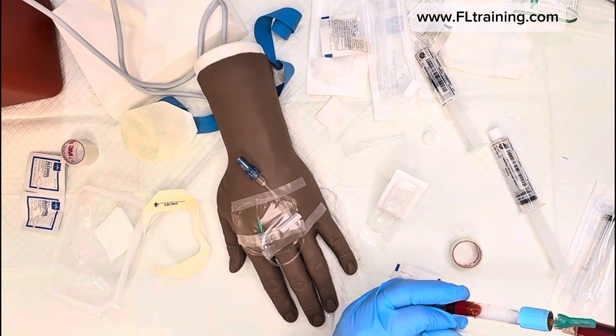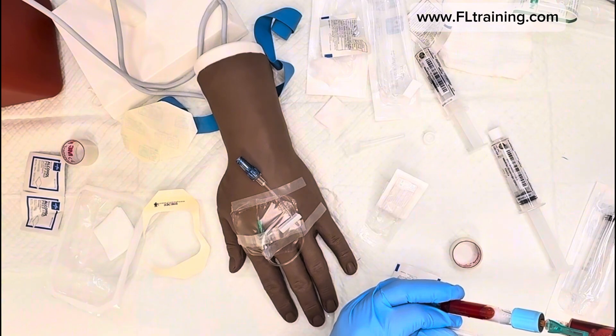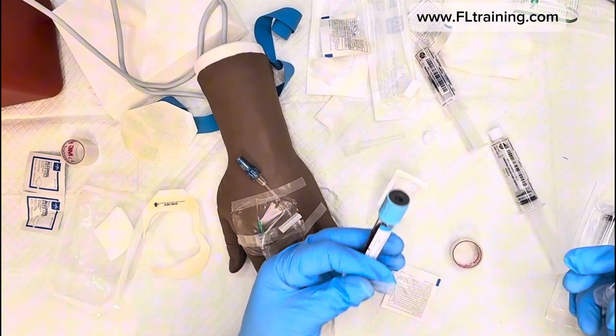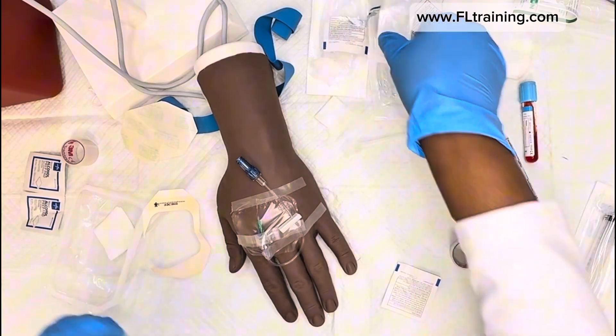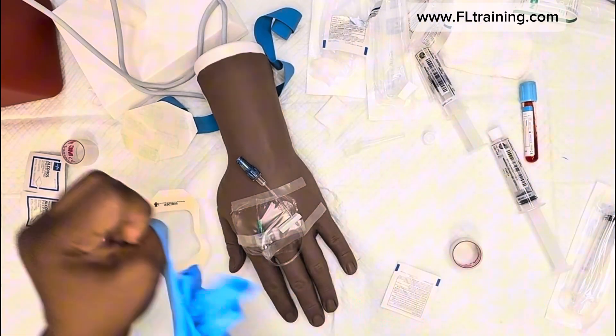It usually stops flowing at about two-thirds full — you don't want to overfill it, because if you overfill it the machine will have difficulty reading it. Don't forget to initial, date, and label your tubing.